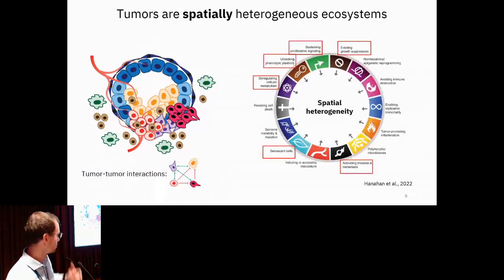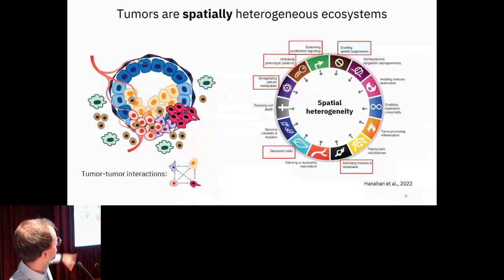that I depicted here from a recent publication. And as you can see, I try to highlight a few of these hallmarks that are linked to some of the spatial features that are linked to the spatial organization of the tumor. And with Athena, we try to capture or to quantify a few of those hallmarks, as you will see later.